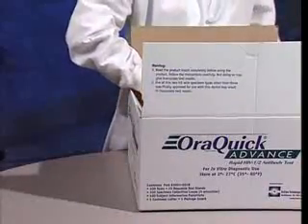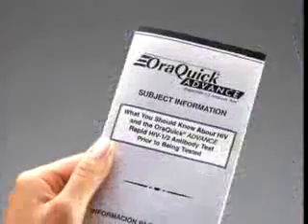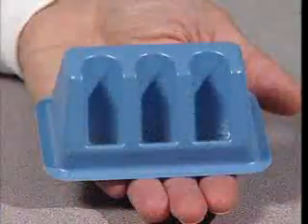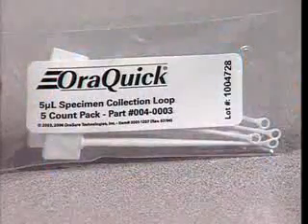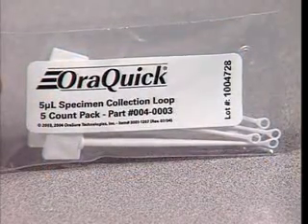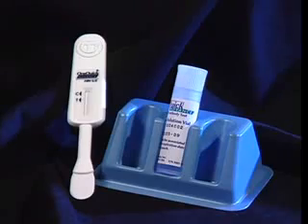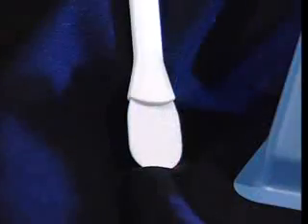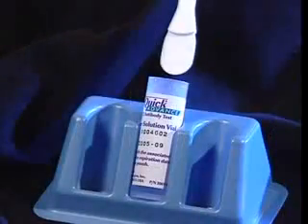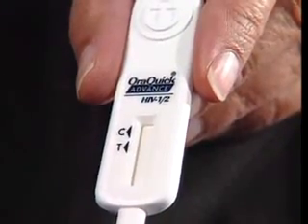With each case of test kits, you will receive the following items: a customer letter, product insert, subject information pamphlets, reusable test stand, collection loops for use with plasma, finger stick, and venipuncture whole blood samples, pouched assays including a developer solution vial, and a test device.